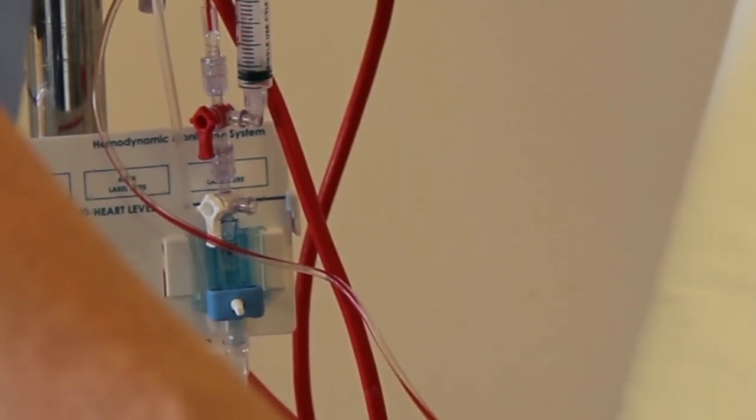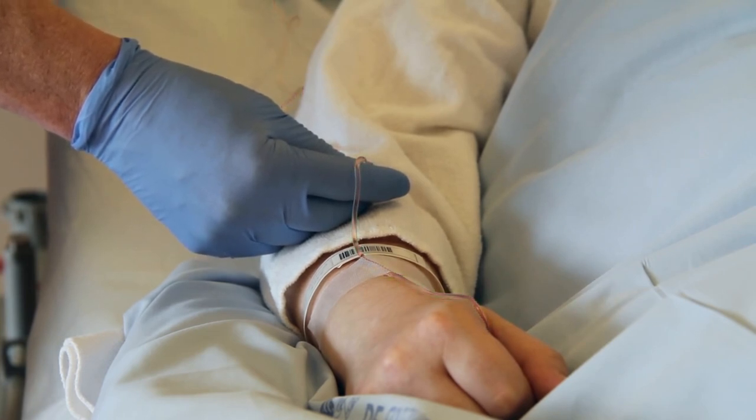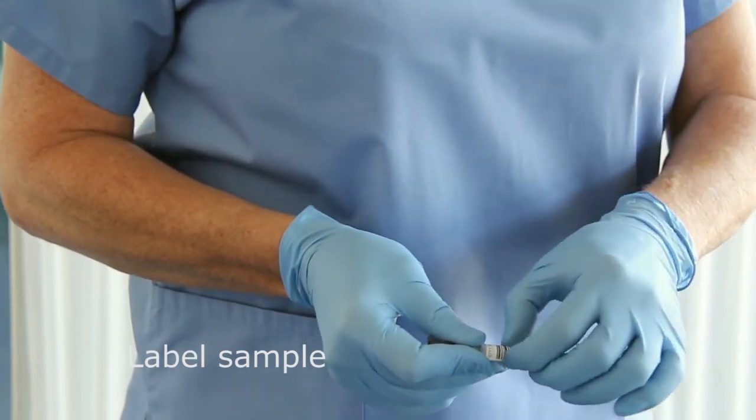Use a flush solution to make sure that the arterial line is clear of blood. Label the syringe with patient ID and immediately transport the sample to the blood gas analyzer.